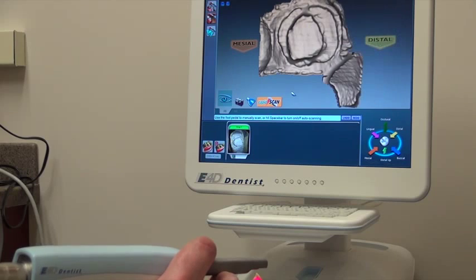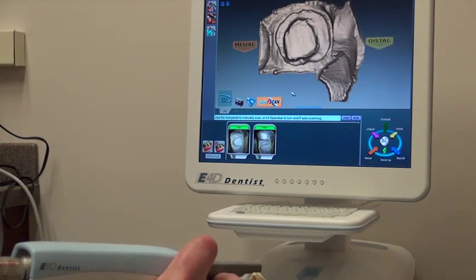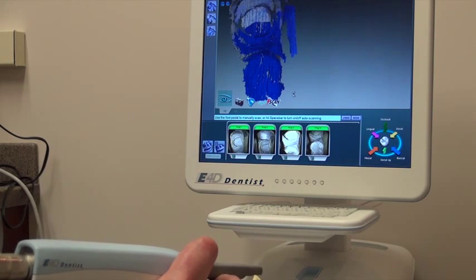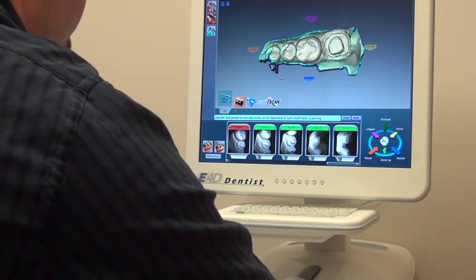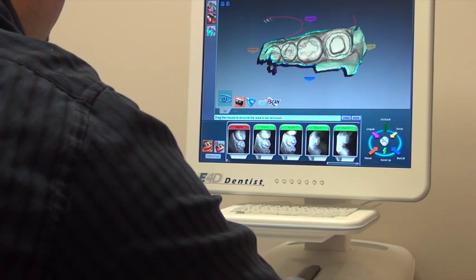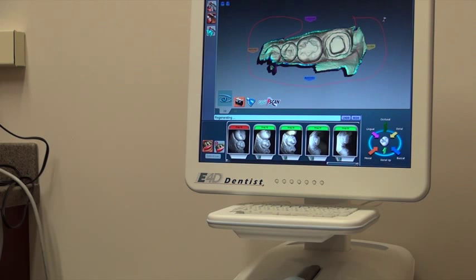We'll take a series of scans. We scanned our model and it looks really good. Now we'll trim up part of the die and just capture what we really want, removing some of this excess material out of the way. We'll trim up our scans and make it a little more easy to visualize.